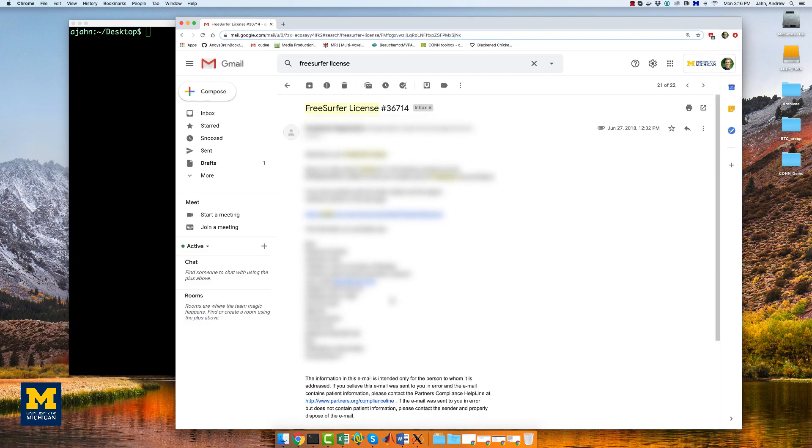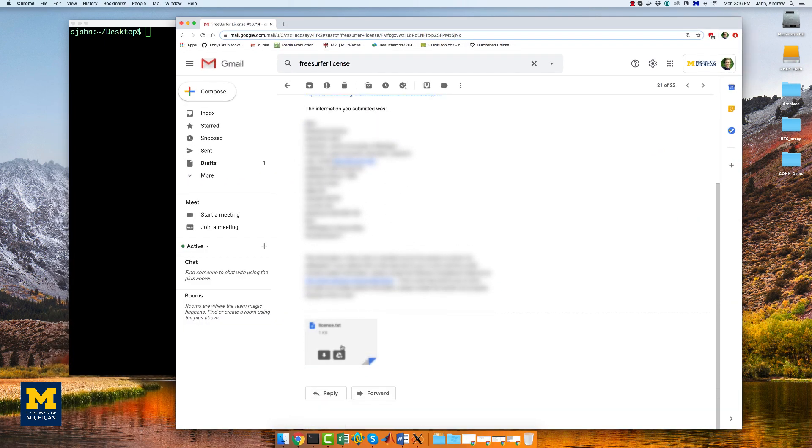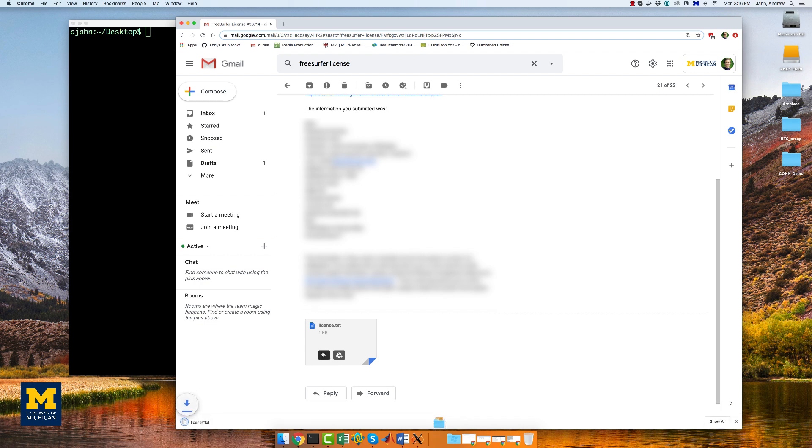Once you fill out the form and submit it, they'll send you an email, and then you download this license.txt file. The next package to install is Docker.